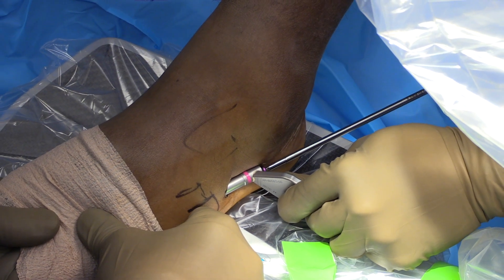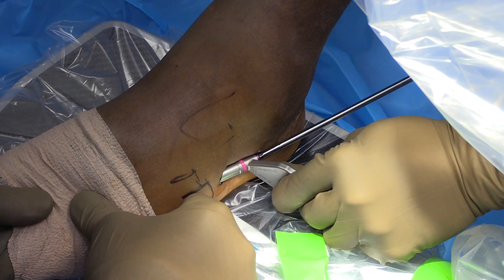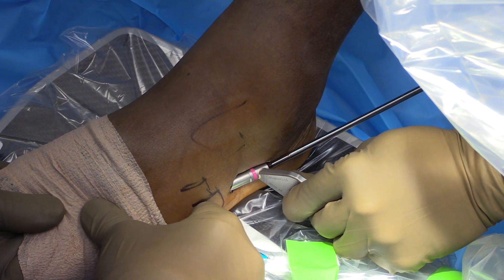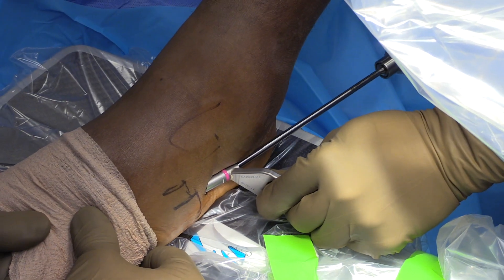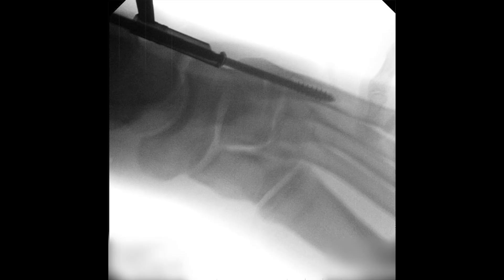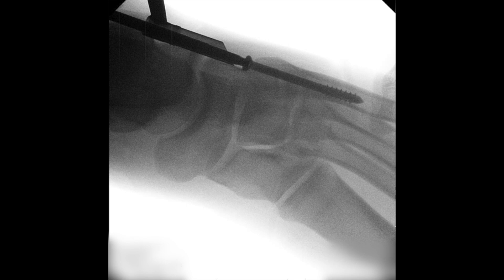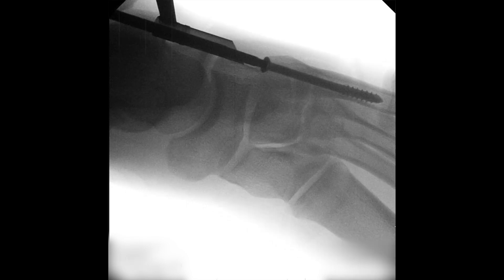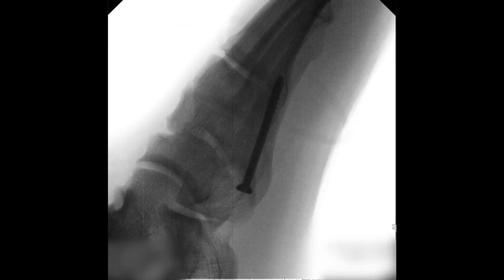A 55 mm, 5.5 mm partially threaded, non-cannulated screw is inserted, reducing the fracture. AP and lateral imaging confirms excellent position of the screw. The wound is then closed with nylon interrupted sutures.